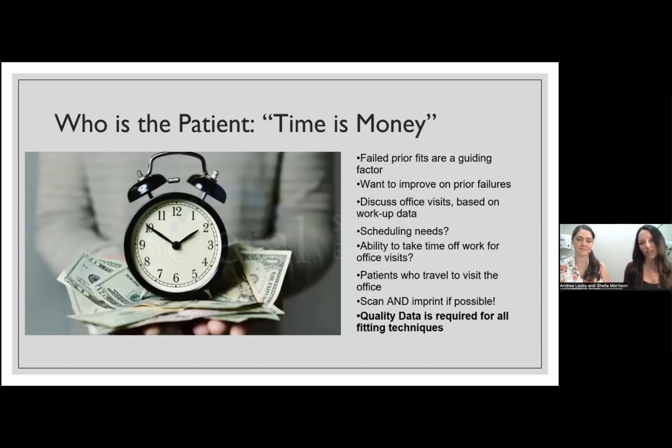Aside from looking at ocular shape, every time, we need to look at who the patient is too. So I usually talk about this when we're talking about fully digital and impression driven and looking at empirical designs, because we definitely want to also take into consideration who this patient is when choosing a lens design. Out-of-towners, patients that have had failed fits in other designs, I usually don't waste any time and I offer them something different. So we'll take an imprint and a digital scan on the same day. There is benefit to doing both on the same day, because if you have a failed impression and then you have to go to your scan, and the patient's already left the office, it's really helpful to have both.